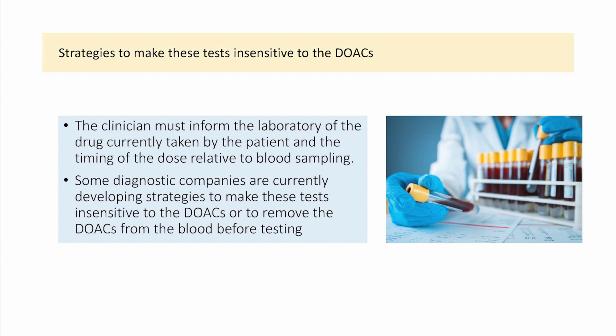Now some companies are currently developing strategies to make these tests insensitive to the presence of direct oral anticoagulants, or to remove the direct oral anticoagulant from the blood sample before testing. This is the strategy they use to try to overcome the effect of direct oral anticoagulants in laboratory coagulation tests.